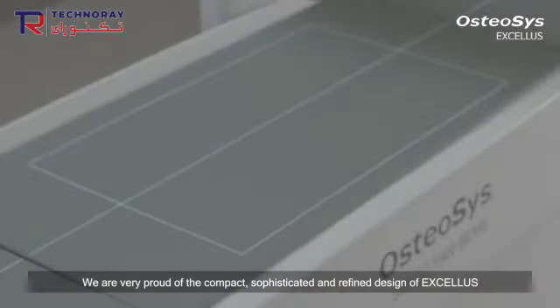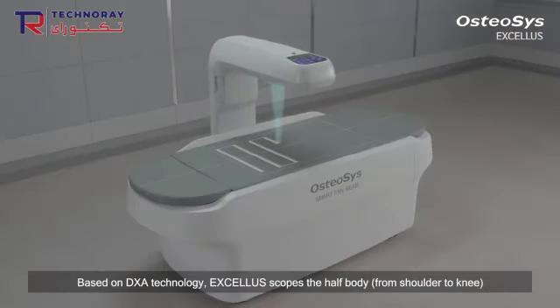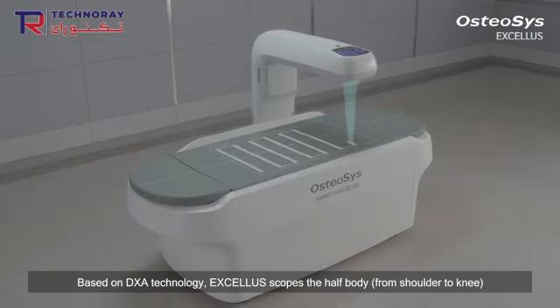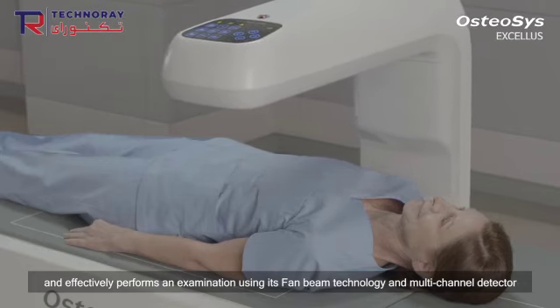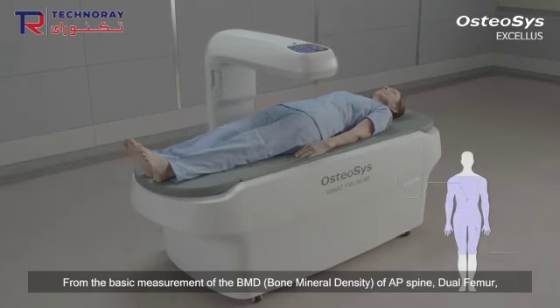We are very proud of the compact, sophisticated, and refined design of Exilus. Based on DEXA technology, Exilus scopes the half-body from shoulder to knee and effectively performs an examination using its Fan Beam technology and multi-channel detector.